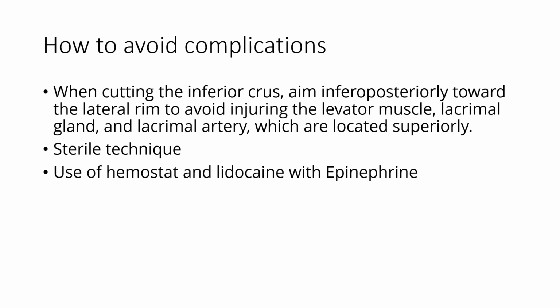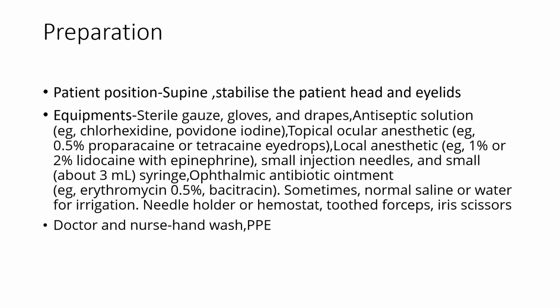Next is how to avoid complications. So the technique itself, like if we are cutting infero-posteriorly toward the lateral rim to avoid injuring the levator muscle, lacrimal gland and the lacrimal artery, which are always located superiorly. And to avoid infection, use sterile technique, and bleeding can be prevented by using a hemostat or using lidocaine with epinephrine.